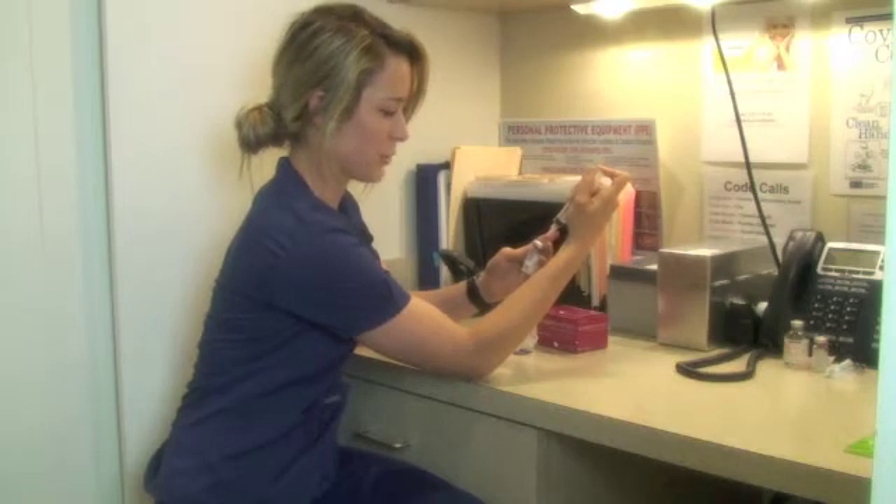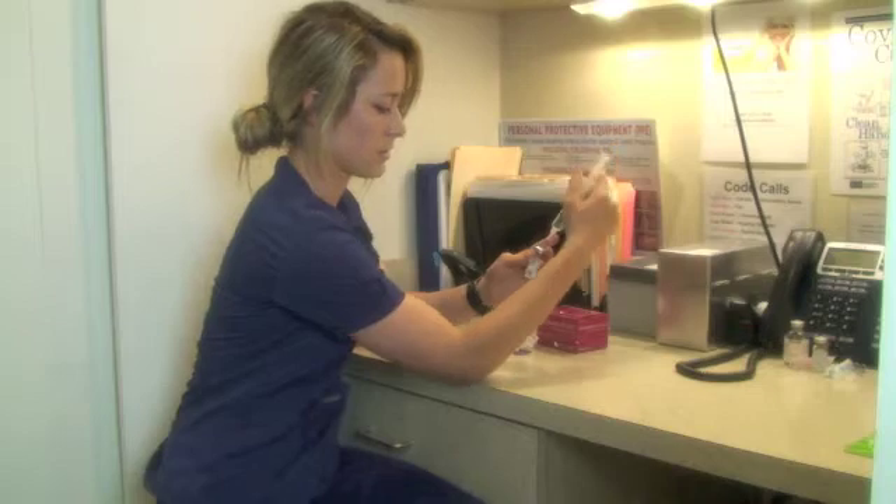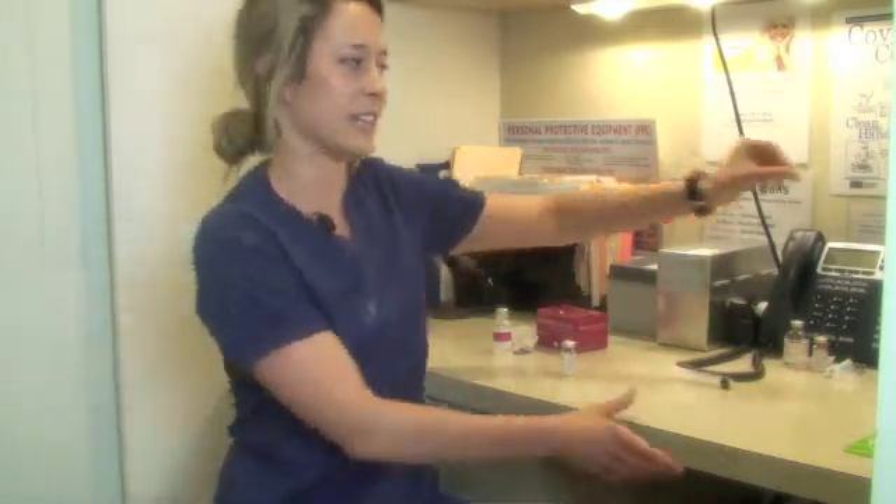Sometimes if you pull the syringe out now, it's going to squirt on you because there's so much compression, so you can let some air out and then just remove it. The product insert says to let it set for two to 72 hours. We know some trainers that let it set for up to a month, but for us, we find that if we let it set for a week, it tends to not clot as much, which makes the injection more comfortable for the patient and faster.